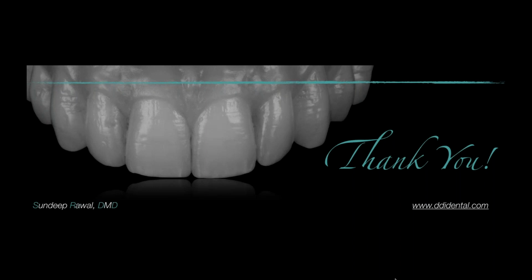The benefits of camera-based navigation are you're able to place an implant and get the same results as static-based guided surgery, but it is dynamic, meaning if I change the plan, I can move the implant in the planning software and place the implant in the new modified position accurately intraoperatively at the time of surgery. The limitation of camera-based dynamic navigation is it is still freehand surgery. So if I see on my screen that I'm drilling to depth, I'm at depth, everything looks good, it's very accurate, and I sneeze, my hand moves.